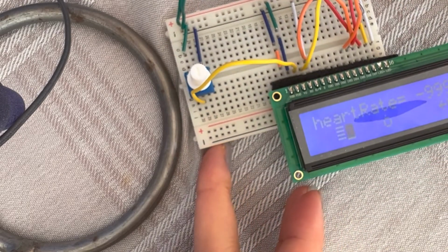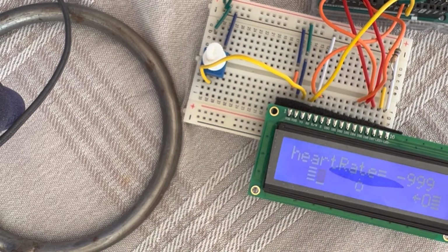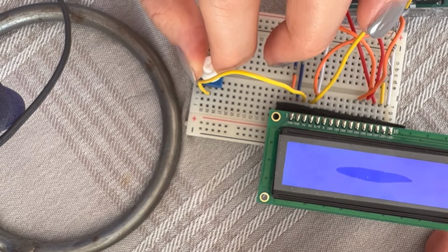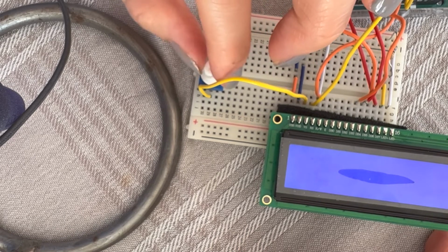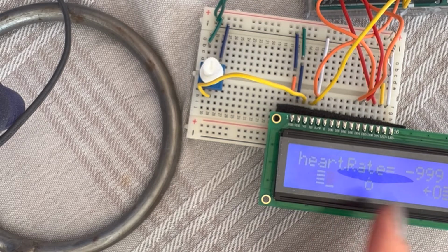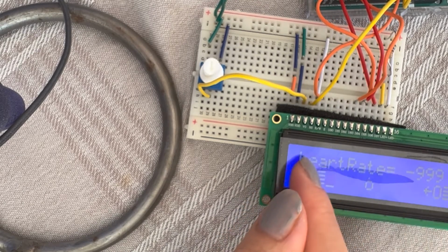Now you see that there is something going on here. Heart rate. I was testing something, so it's there, but it's not running right now. This one, you play around with in some computers. You don't need to move this until the end. Maybe everything shows up at this point, but in our case, it should be at the last part. If you don't see anything, just move this around a little bit to see what's happening. Right now the text is there because I had already connected this and uploaded the code.